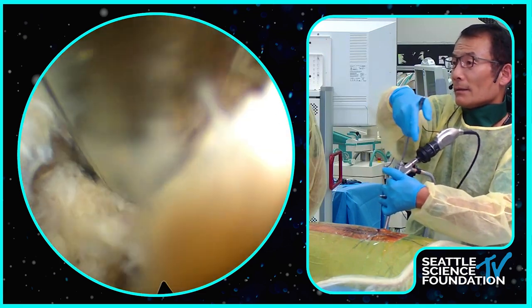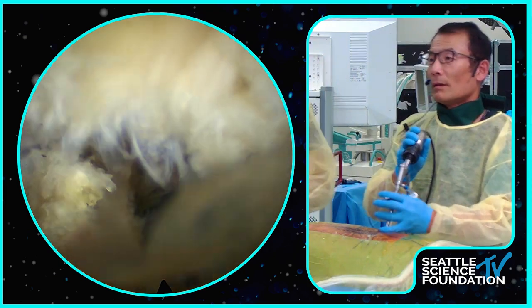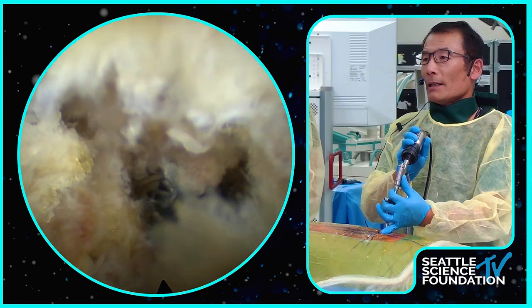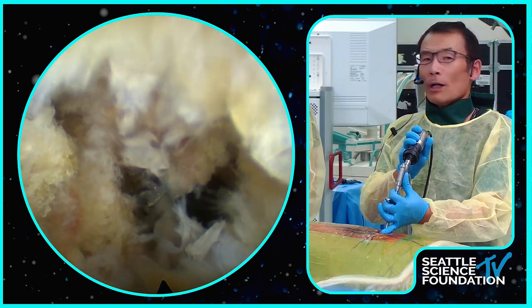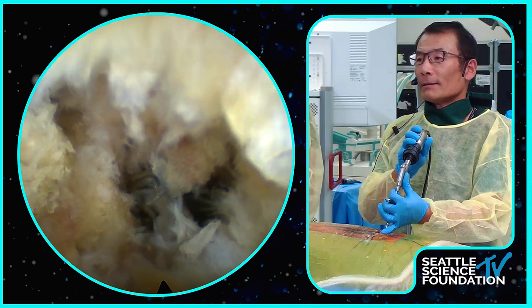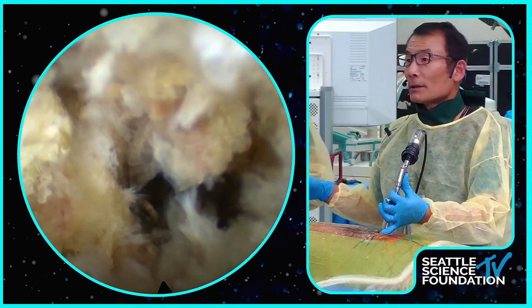Shen, can you tell us what is the typical width of your implant? 10 millimeters, 8 millimeters? Usually for L5S1, I try to use 12 or 14. Height or width? Width. Big grabber.